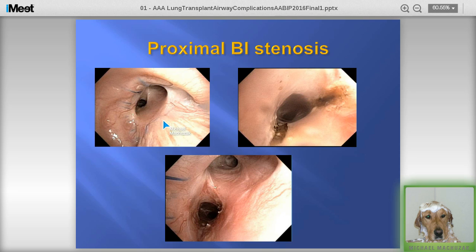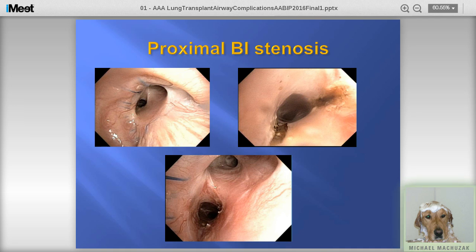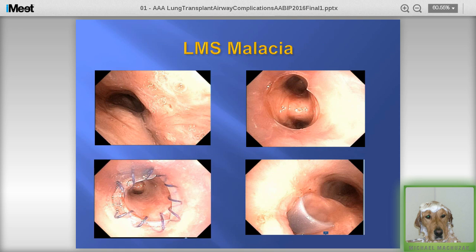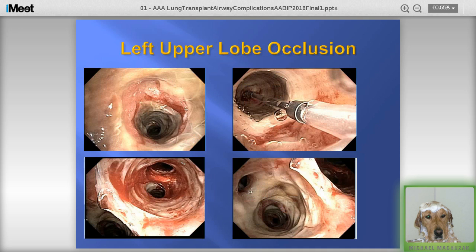A simple situation: a bronchus intermedius stenosis — a pretty tight stenosis just distal to the airway. Two cautery cuts are made. What I like about the cautery blade is the injury and heat are fairly localized; we get a nice cut, a nice stretch, and go from a tight airway to a decent-sized airway. This should be the first thing you do: try to cut and dilate, whatever your modality, rather than jumping straight to a stent. In the case of malacia — a patient who failed positive pressure ventilation with recurrent pneumonias and intractable cough — the left main stem is not a straight shot, so two stents were sutured together to approximate the bend, with a notch for air and mucus clearance in the left upper and lower lobes.